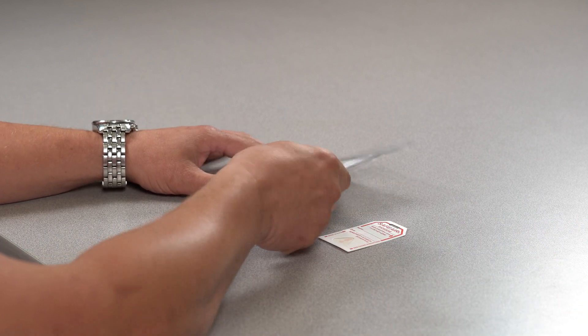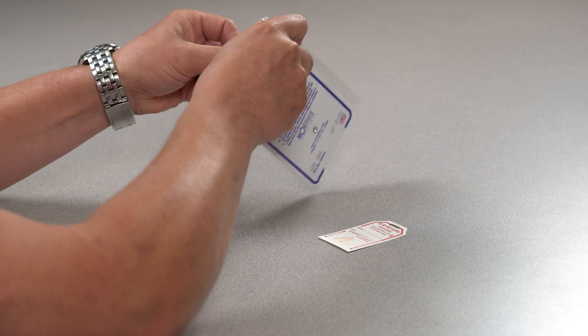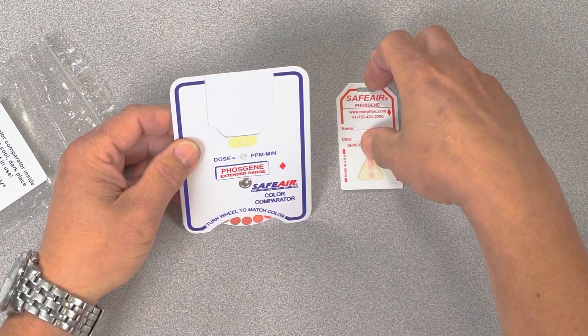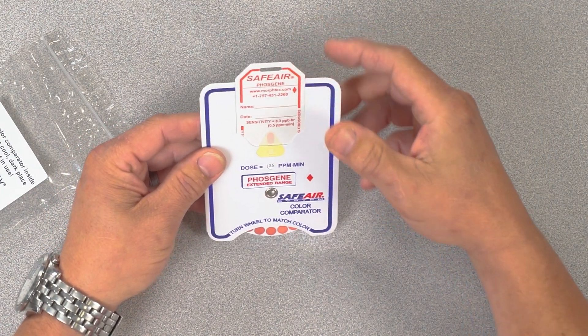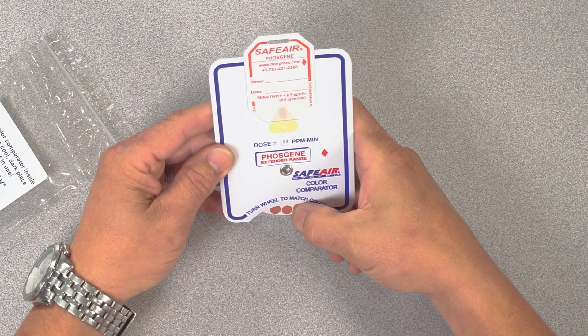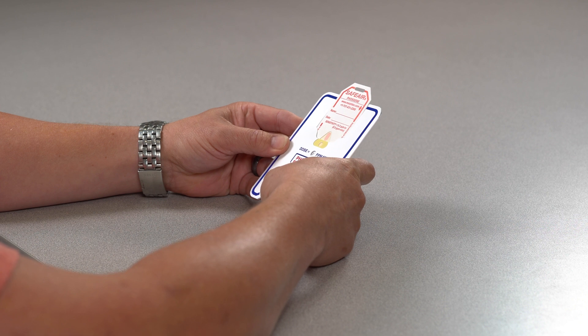The SafeAir Color Comparator from Morphix Technologies is an optional accessory for use with the corresponding SafeAir badge. The color comparator is used to determine the exposure dose a badge has received. This is the SafeAir Phosgene badge and color comparator. Comparators are available for a number of SafeAir badges and work the same as demonstrated here.